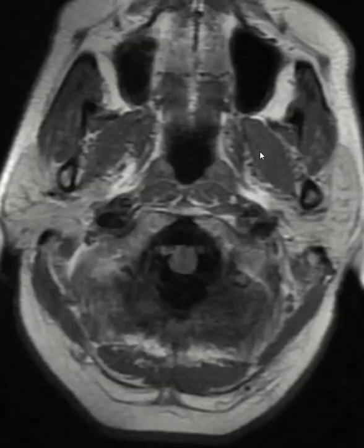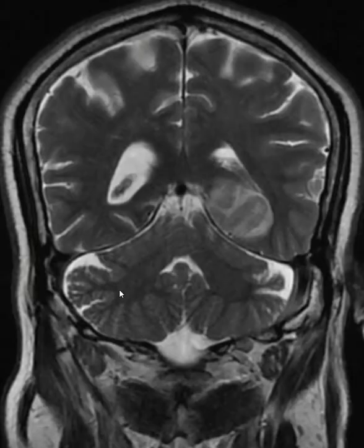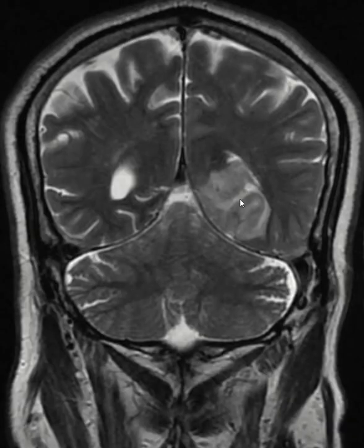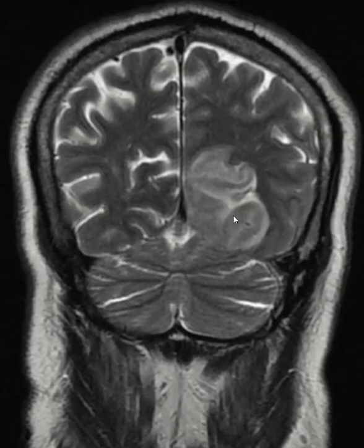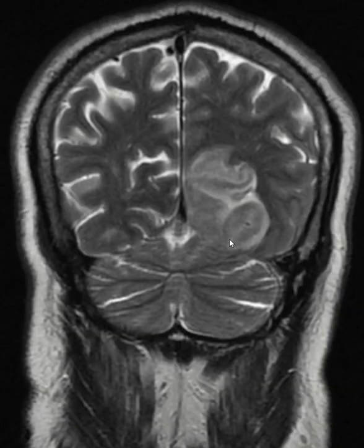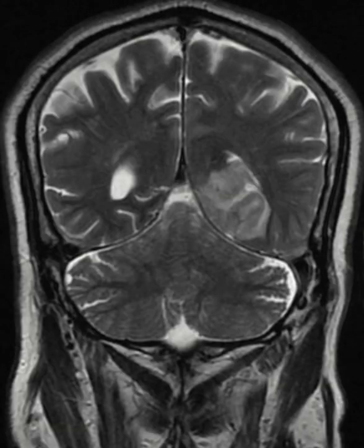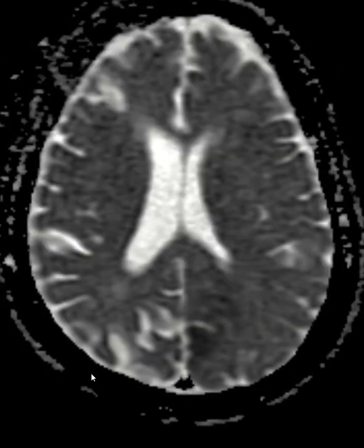Let us look at T2 weighted images. Again, you can see it is predominantly hyperintense, but areas of hypointensity are there. On T1 weighted images, again it will be hypointense. And on coronal images, you can see the affected PCA territory. There is some mass effect, but it is not really significant — it is just pinching the lateral ventricle.